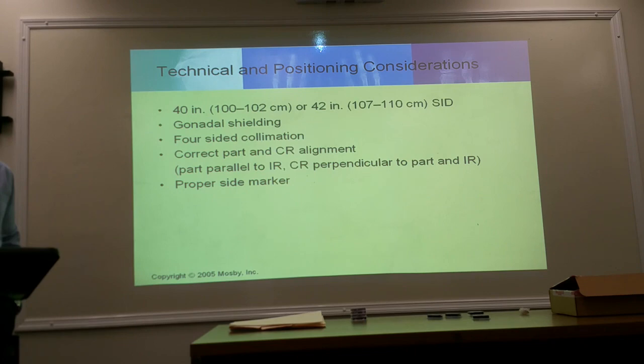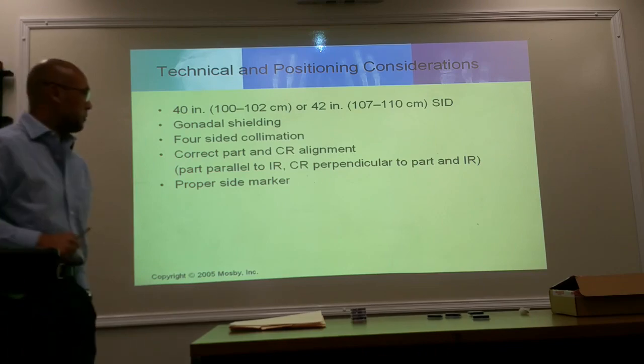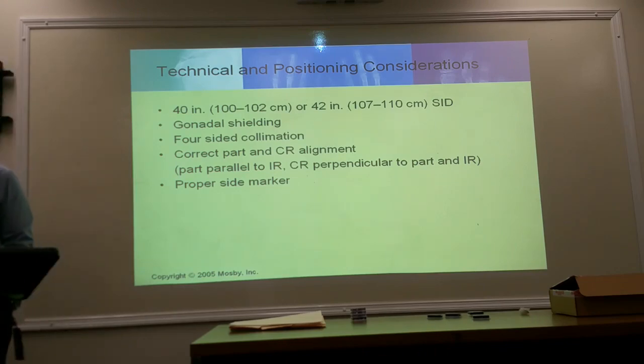You can label with the computer, because now you can annotate. What's more important is that the markers have your initials on there, or some kind of identification that says that you're the person who took the X-rays. That's the important part of it. So, proper side markers.